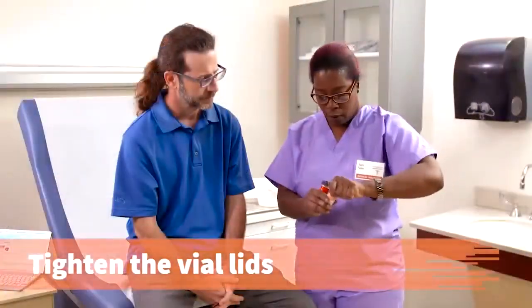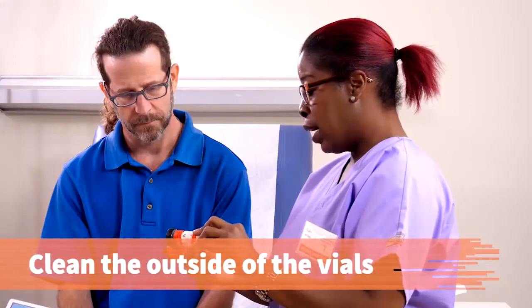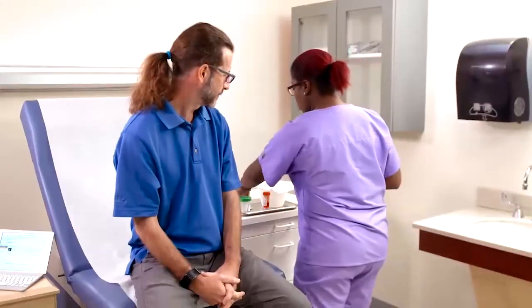Instruct the patient to tighten the caps completely and wipe the outside of the vials with alcohol wipes or to wash carefully with soap and water. I will also put a few alcohol wipes in there for you to wipe the outside of the containers.